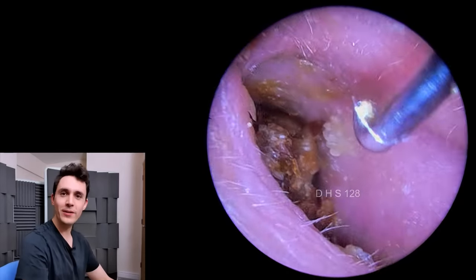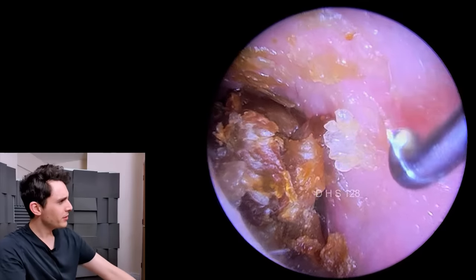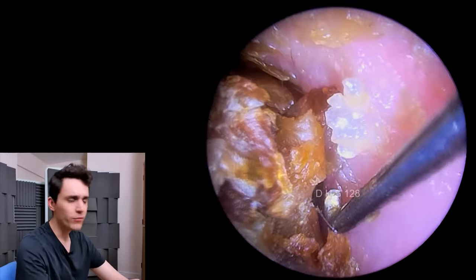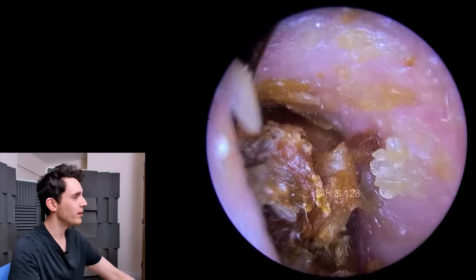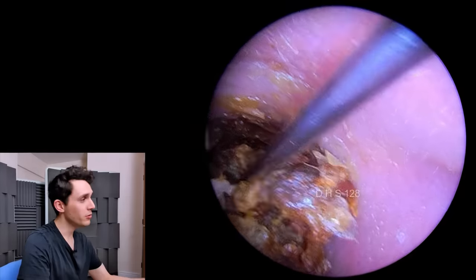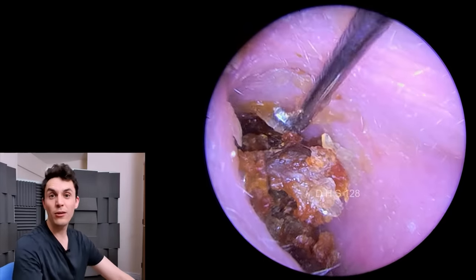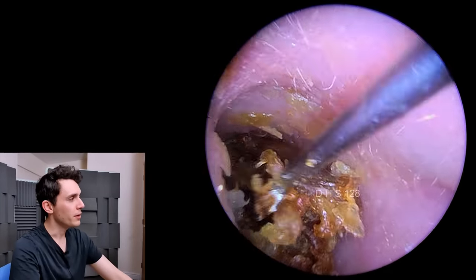Hey everyone, it's Connor here from Durham Hearing Specialists. I hope you're doing well and welcome back to another interesting video. I've got a couple of tools here to show you, which I haven't really formally introduced, but what we're going to do is use these tools to basically dig out a lot of dead skin from this ear canal.